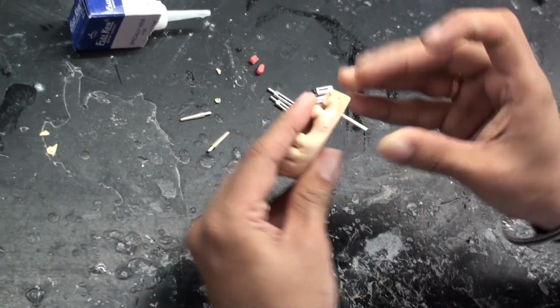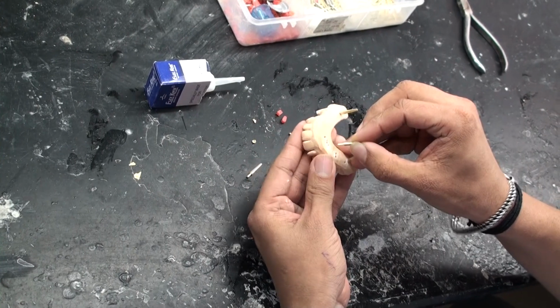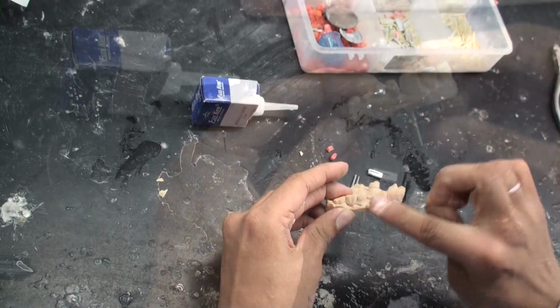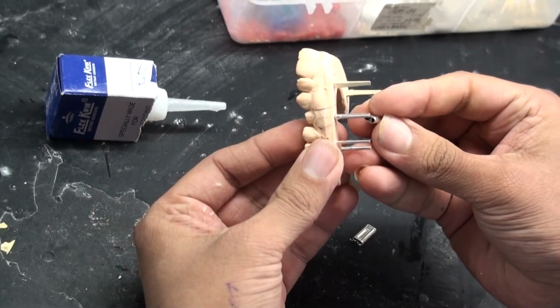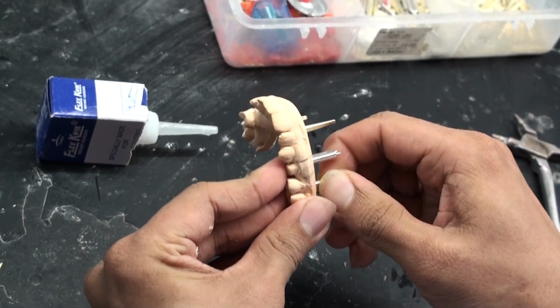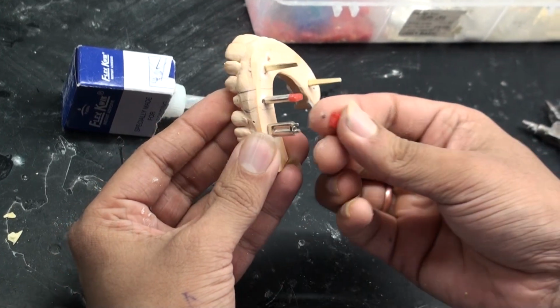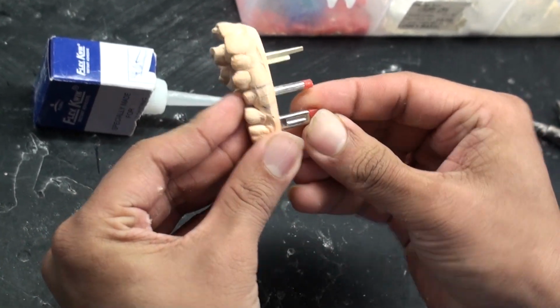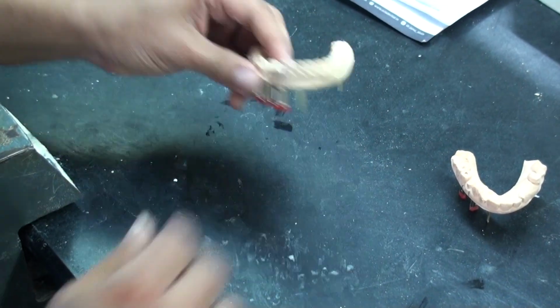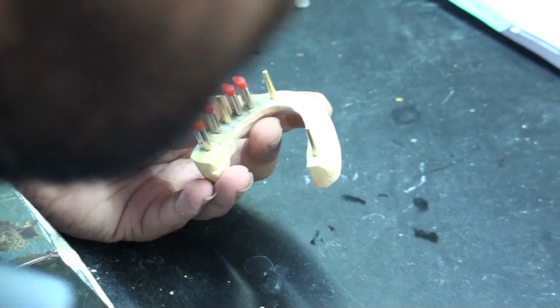Takes a bit of glue, puts it on the pin, and inserts it into the model. He's doing that for various other teeth, and he's got a little double pin there as well. He's doing the same thing, puts a bit of glue on it, puts it in there, and now he just put actually the sleeve. There we go, he's putting the sleeves on it, and that red little bit is to avoid getting any plaster flowing into that tube and getting packed. Once that's done, that's the finished way, and then he takes the model and starts making some grooves into them.